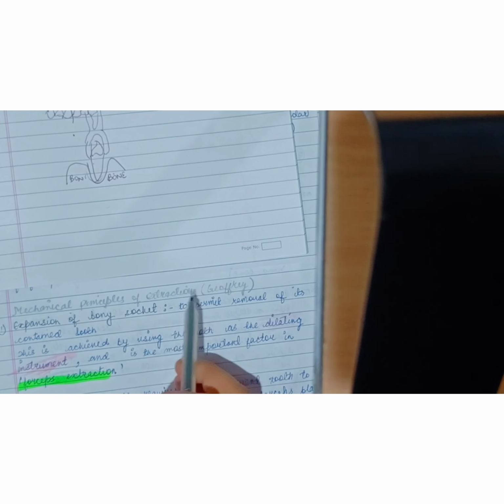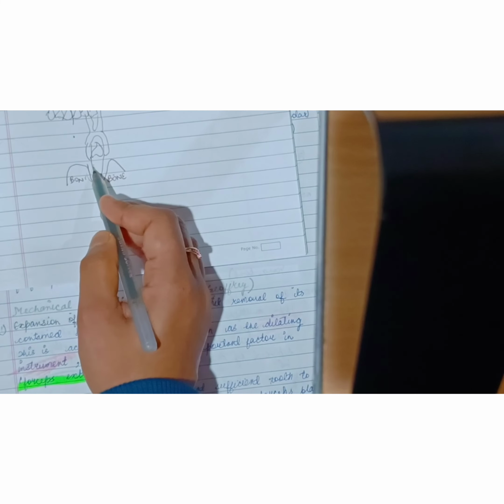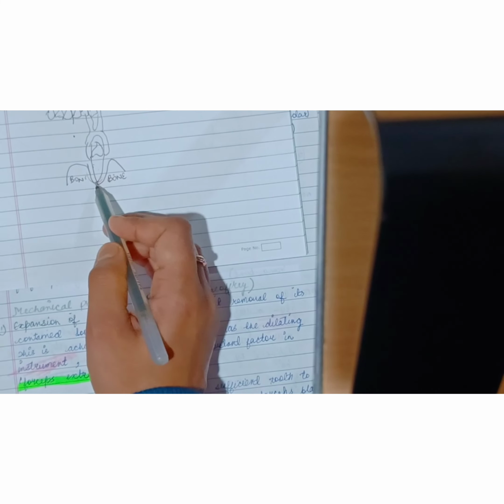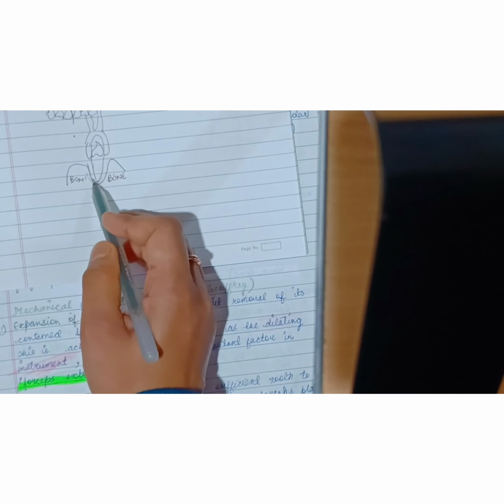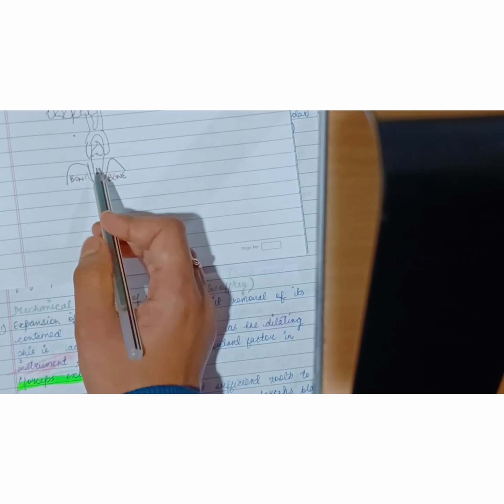Mechanical principles of extraction are: first one, expansion of bony socket to permit removal of its contained tooth. This is achieved by using the tooth as the dilating instrument and is the most important factor in forceps extraction. So, if this is the tooth which is to be removed, this is the bony socket, this is the bone, this is the bony socket. So, the tooth is used as a dilating instrument.